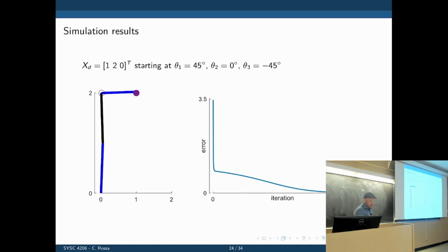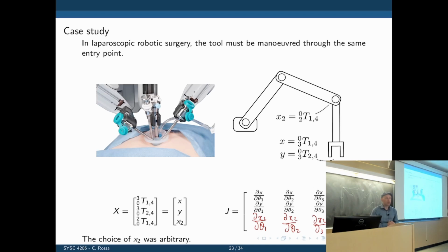So here is the same simulation. Could you please repeat why we're getting that extra constraint? I want the extra constraints because I want the robot to always go at a straight angle. I want it to go to this point, but I want it to go to that point following this orientation. Also, since there's just the one solution, we know that it's straight.